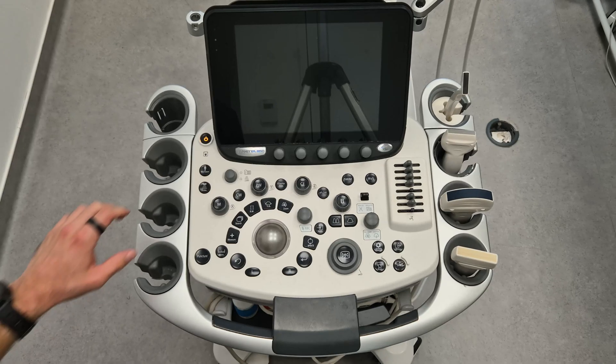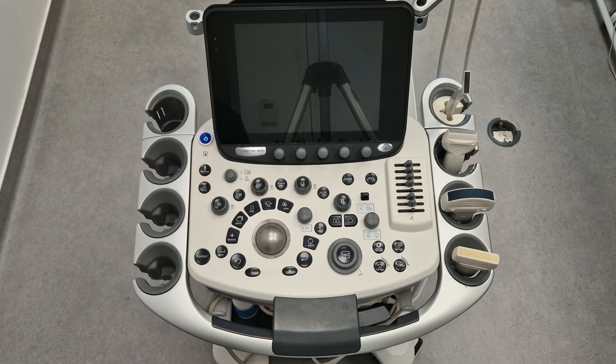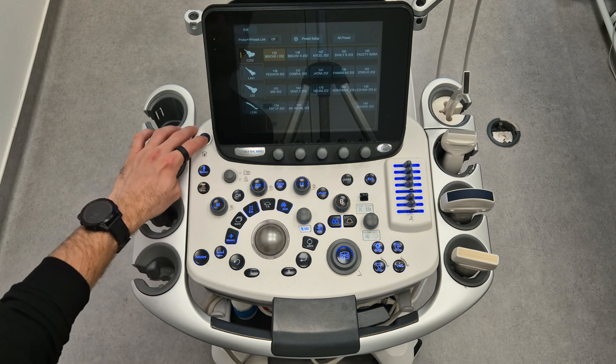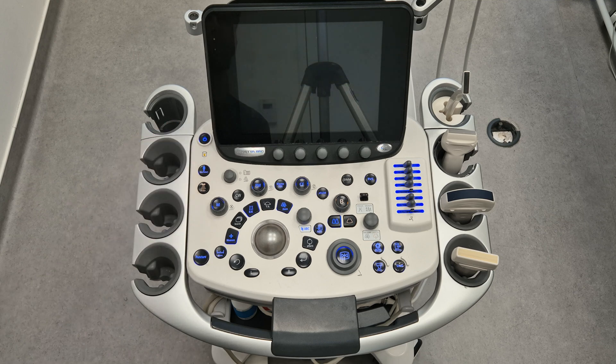Power button. This may seem obvious, but knowing where the power button is can save you precious time, especially when switching between machines. Always check it first to ensure your system is on and ready. When you finish the work, don't forget to turn the machine off.